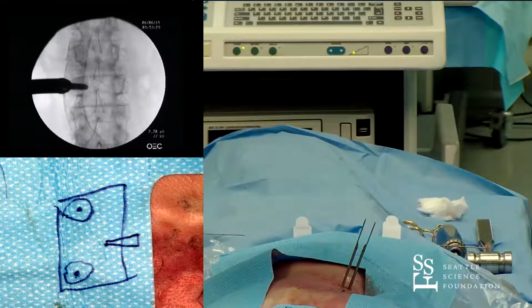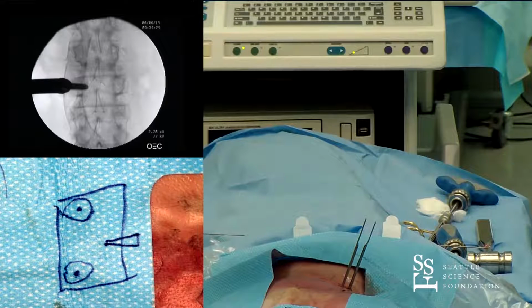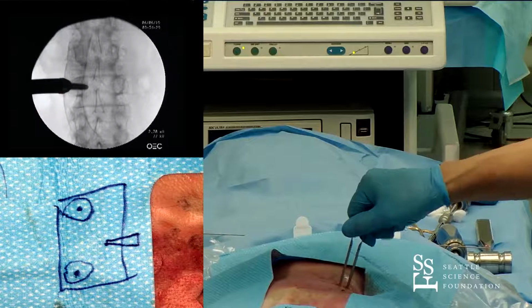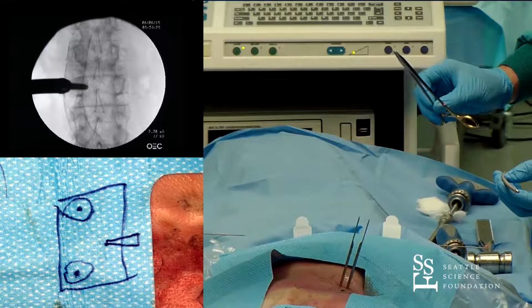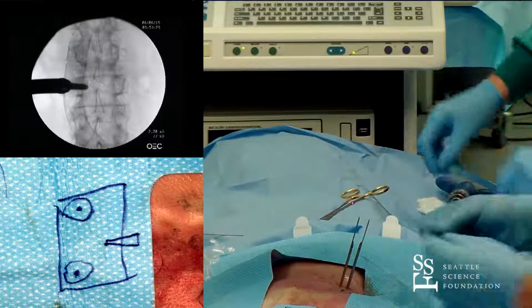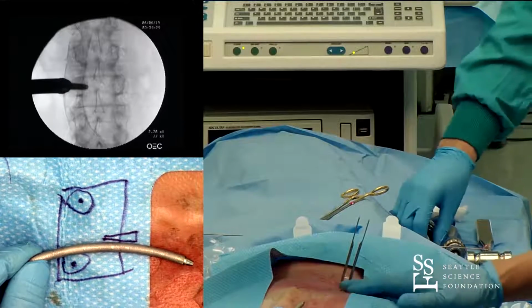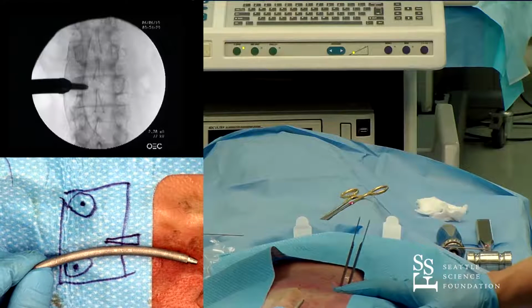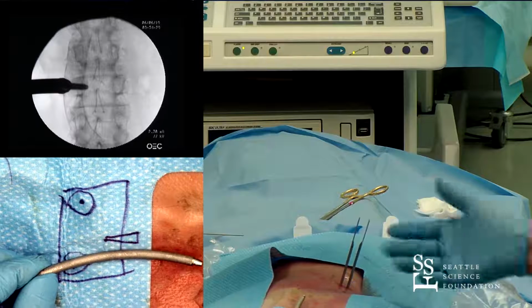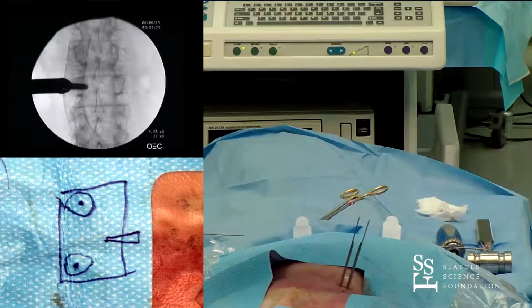So at the end, we need to fashion a rod onto this screw. These towers provide a guide of where to put the rod in. So we'll do one more. Let me see the rod. Obviously, the rods come in different lengths. It really depends on how many screws we put in. I think today we'll put maybe two or three, and then we want to do this on both sides, on the left and the right side.